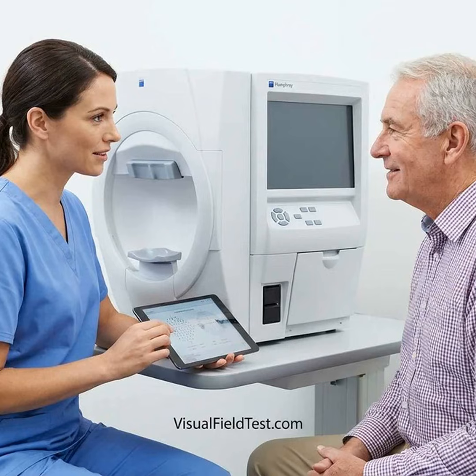This was an absolute improvement of 14.5 percentage points. The main benefit occurred in the second eye tested. Reliability was 86.6% with the video versus 73.5% without it. A later quality improvement audit used a 4.5 minute video in patients with no previous experience of standard automated perimetry. Reliability increased from 66.7% before the intervention to 87.5% afterward, an improvement of 20.8 percentage points. The video explained fixation, blinking, the changing brightness of the lights, and when to request a pause.